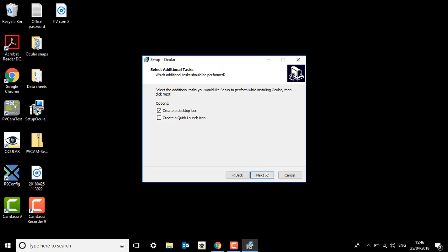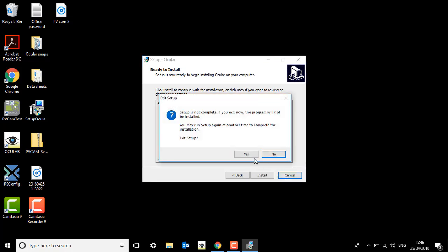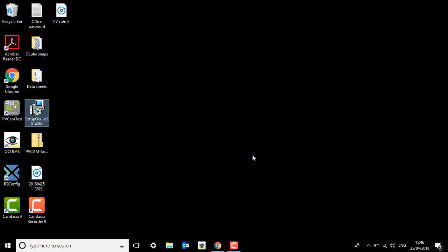Next again, and then finally install. Once you've installed, press finish and please restart your PC before you try to open Ocular.